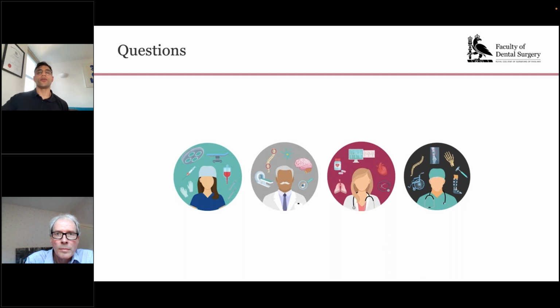I guess if your research project is getting the patient or the patient's parent to take photographs, then you're sort of limited in what's available to you. I think a bad photograph is acceptable as long as it doesn't give you an inaccurate, or probably more accurately, a misleading representation of the teeth. So a bad photograph which makes it appear as if there's caries when there isn't is worse than no photograph at all. However, a less than ideal photograph is probably better than no photograph.